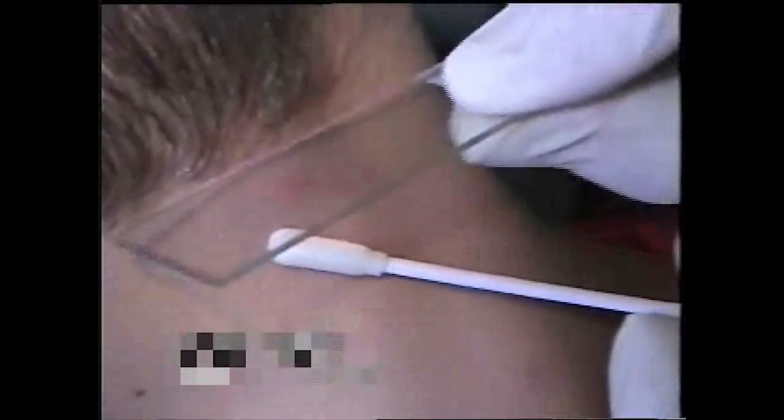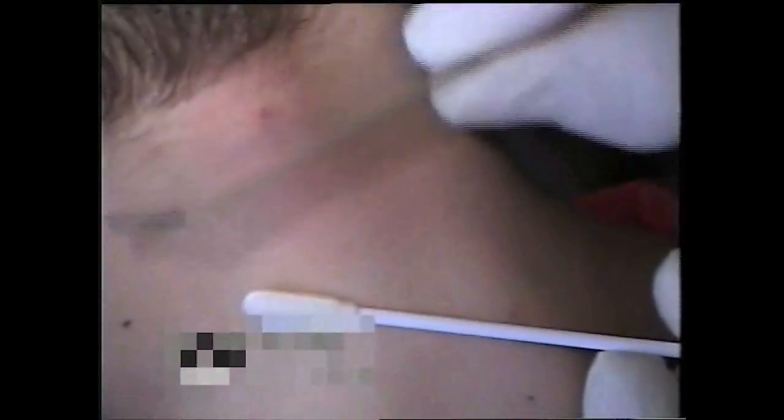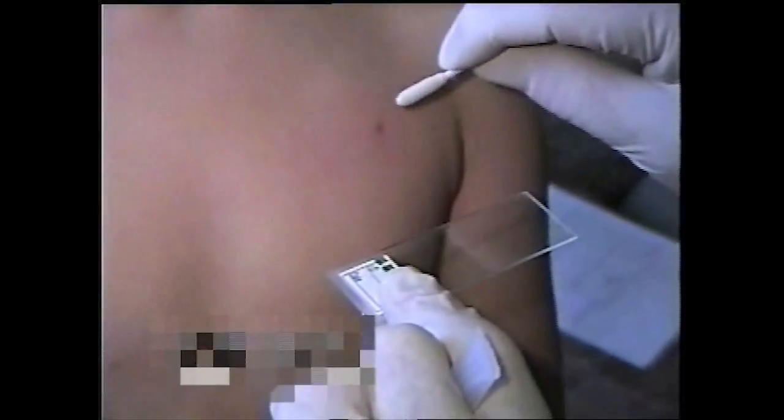To ensure an adequate amount of skin cells is collected, particularly with maculopapular lesions, we recommend also using the swab to wipe the skin cells off the edge of the slide used to scrape the lesion.